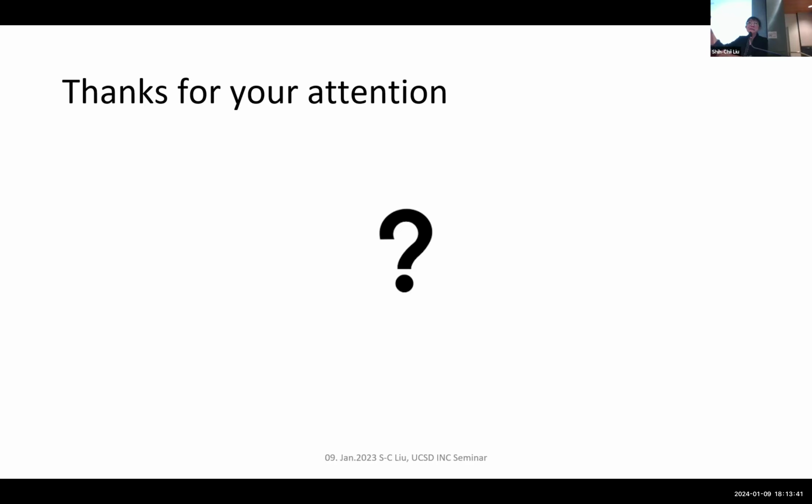So it could be that if you put it in a higher level area, you're not going to see dots. How would you stimulate for depth perception? Yeah, how would you stimulate to perceive depth? 32 by 32, not going to. I don't think we can. We haven't thought about it that far yet. I think the answer is that you have a stereo vision system or a depth camera, and then you encode the depth into the phosphene directly. So you can only light up a phosphene if something is close enough. Yeah, that's true. In the end you use codes rather than an image-like output.